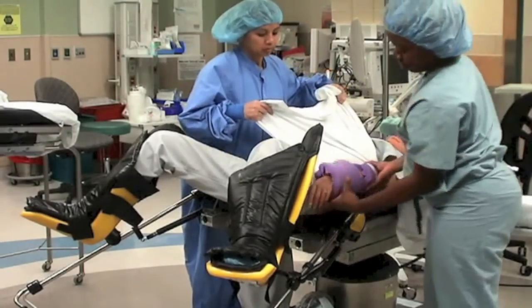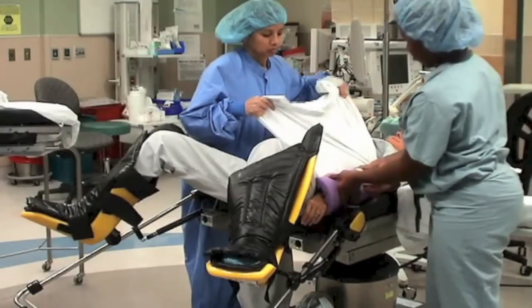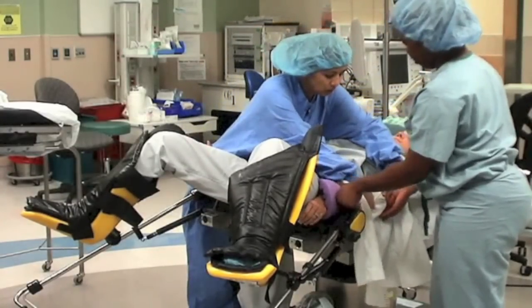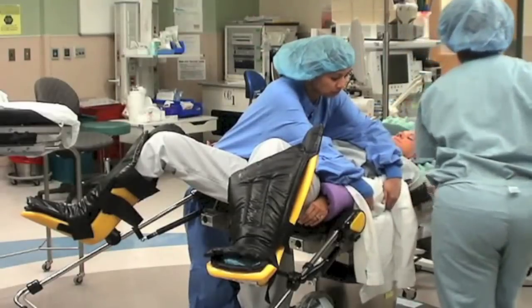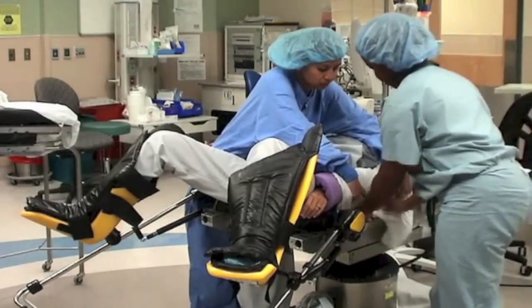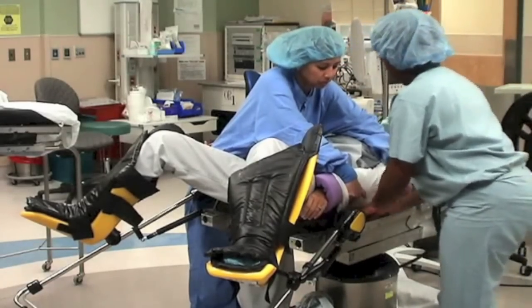Two people work together to tuck each arm, with one person holding the arm and the other person lifting the bed sheet. Then one person lifts the OR bed mattress and the other person tucks the sheet beneath the OR bed mattress.